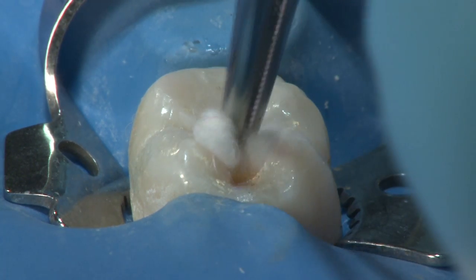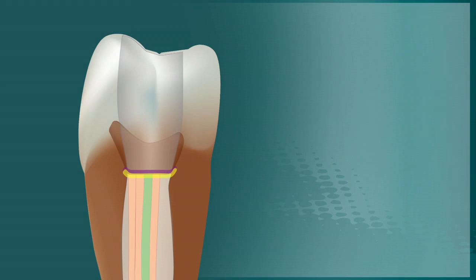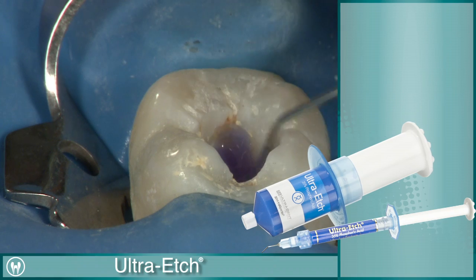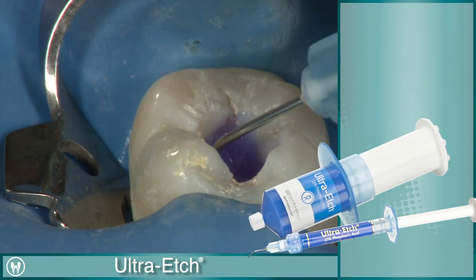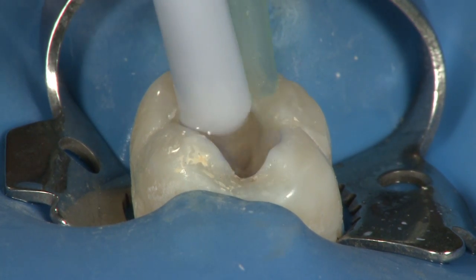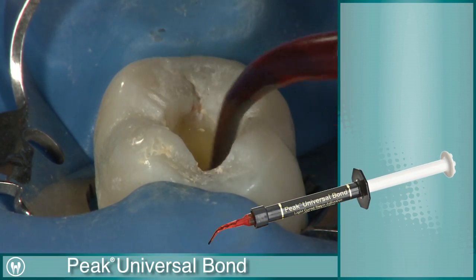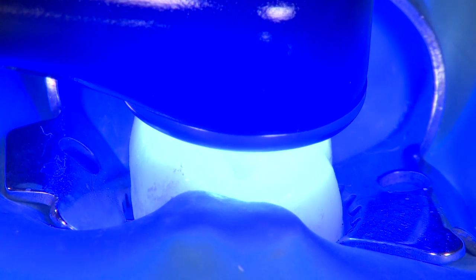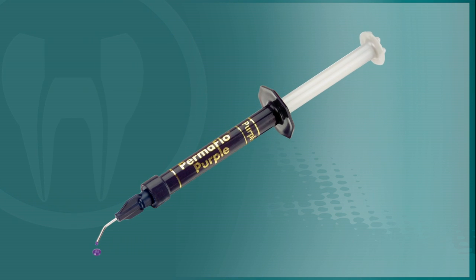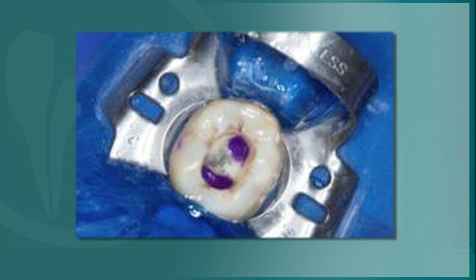To seal the pulp chamber, begin by cleaning the walls and floor of the pulp chamber with cotton pellets soaked in isopropyl alcohol. After the EndoRes has set, sealing the floor of the pulp chamber is important to prevent coronal leakage. Etch the entire tooth structure inside the pulp chamber. Leave Ultra Etch for 20 seconds, then rinse the tooth thoroughly with copious amounts of water. Place your bonding agent of choice. A syringe-delivered bonding system such as Peak makes this procedure quick and easy. Light cure the adhesive. Permaflow Purple or another flowable resin should be used to seal the floor of the pulp chamber. The purple color of Permaflow Purple simplifies locating the canal access should future therapy be needed.